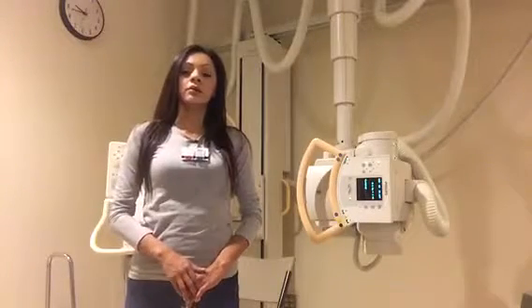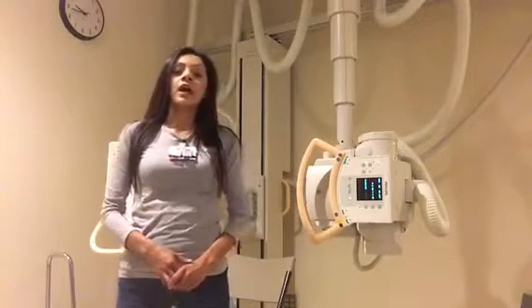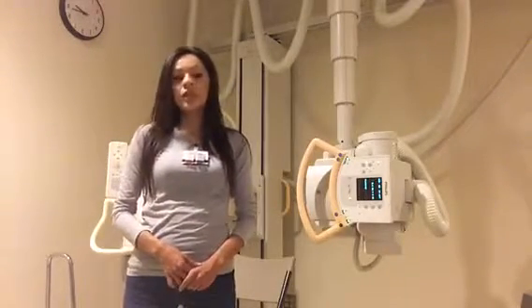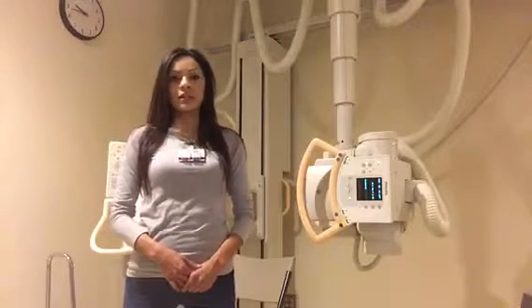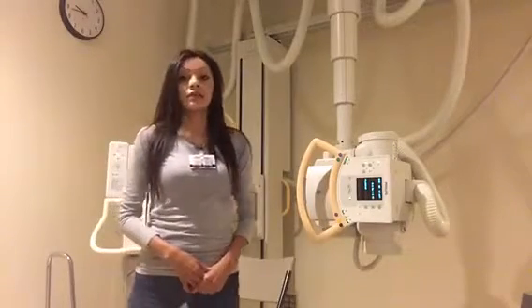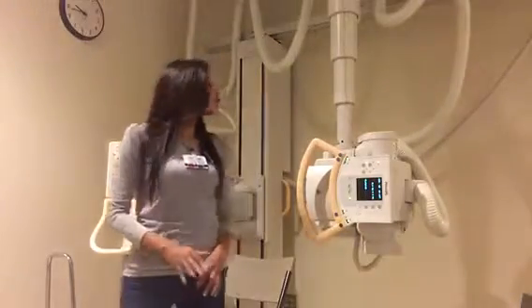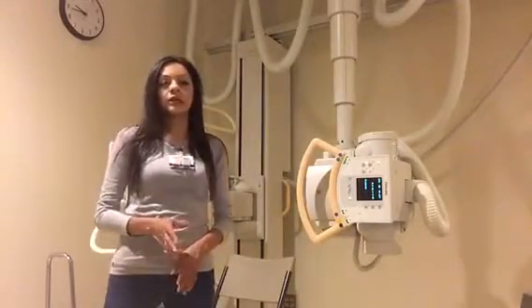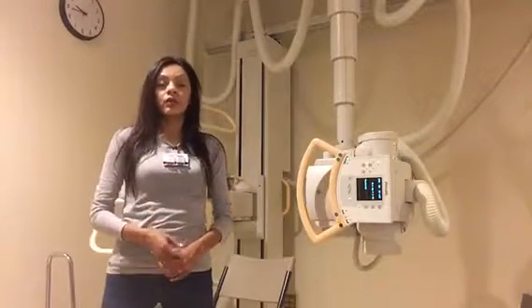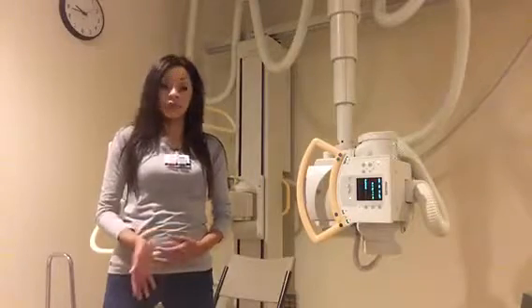Our next projection is going to be the parieto-acanthial Waters, maxillary sinus. My technique for that is going to be 85 at about 8. And then our final projection is going to be the submental vertex, SMV, ethmoid and sphenoid sinus, and my technique for that is going to be 85 at about 14. For all my projections, I am going to be at a SID of 40 inches, and I am going to be collimated to an 8 by 10 or a 10 by 12.